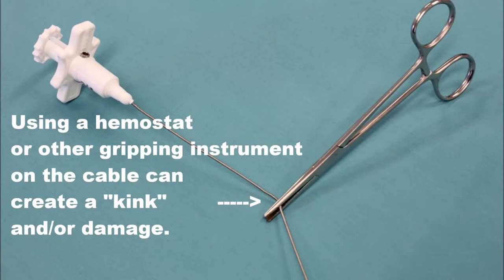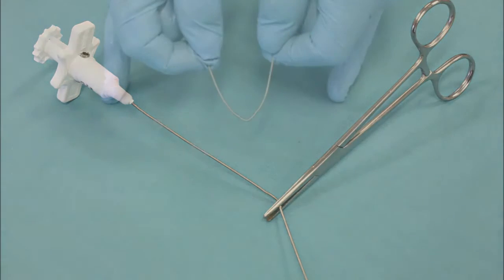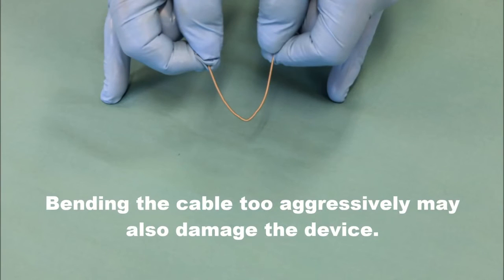Using a hemostat or other gripping instrument on the cable can create a kink or damage. Bending the cable too aggressively may also damage the device.